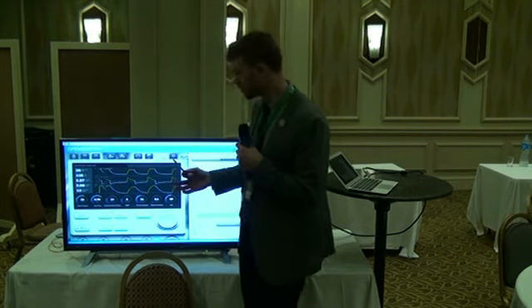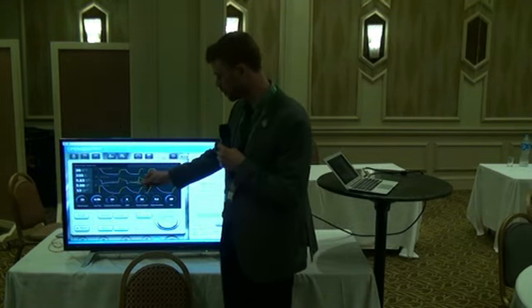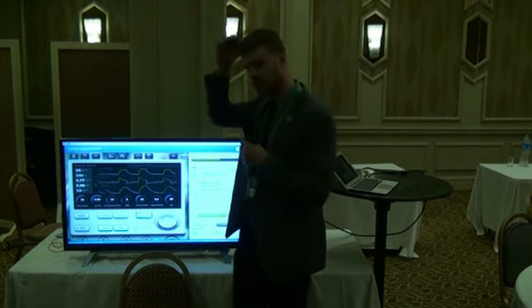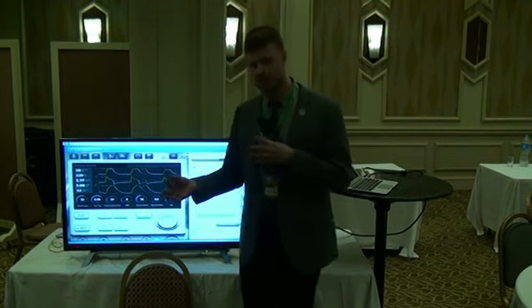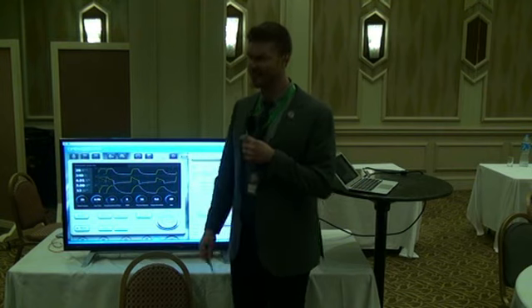Yeah. All right, so you guys are exactly on track. So the couple of things that you can pick out, this is always true, right? But it's most important in somebody with reactive airways disease or some obstructive process, even bronchiolitis, is we talk about time constants. And what's the time constant? Compliance multiplied by resistance. Man, you guys are good.